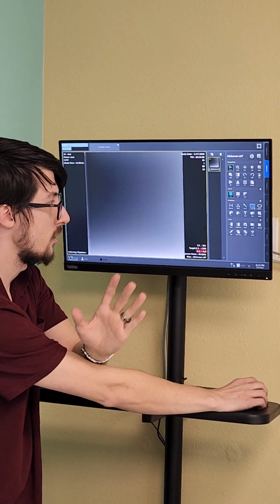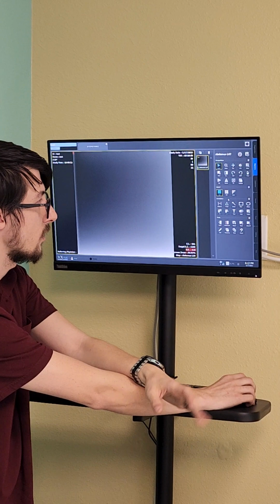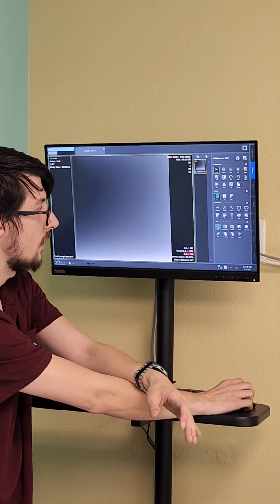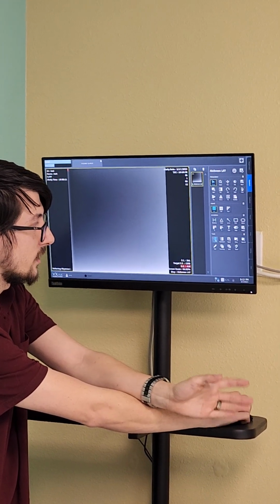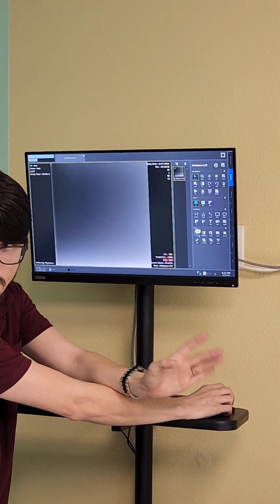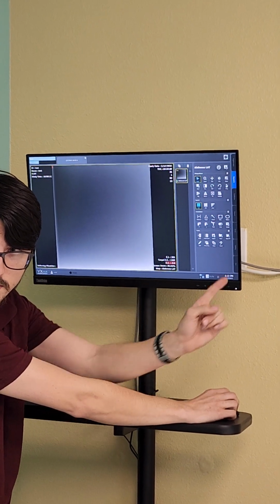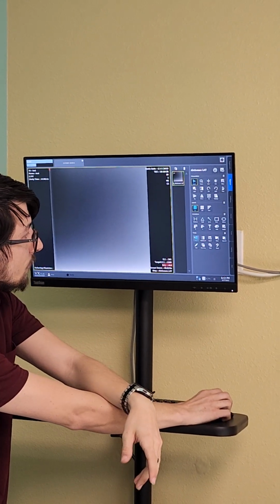Distance, angle, arrows, and so on. You can go on for hours doing all kinds of different things. The main thing that y'all probably need to know is send. So that will send the image to y'all's PACS system. I already called Smart PACS, so I got that set up to send to that computer.